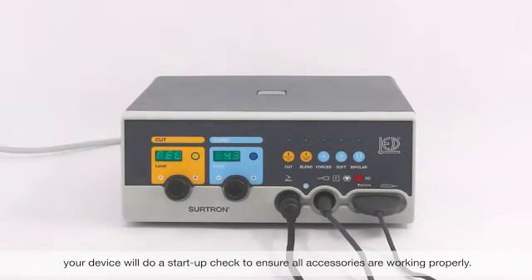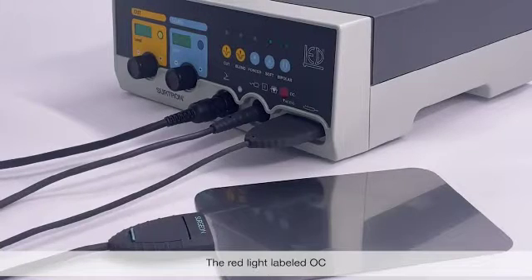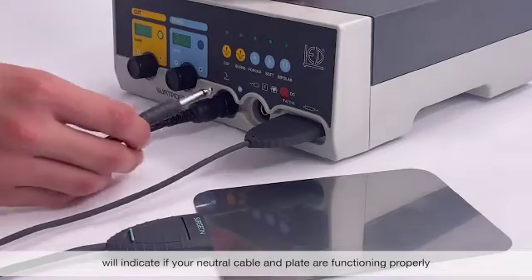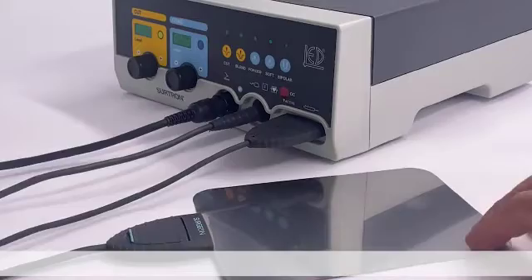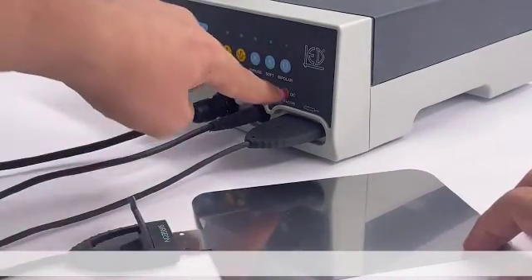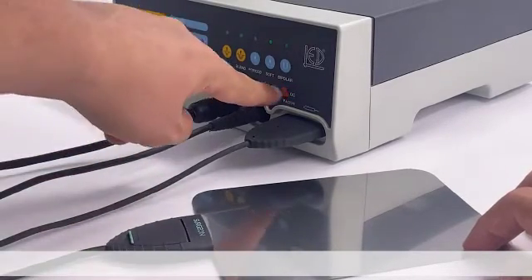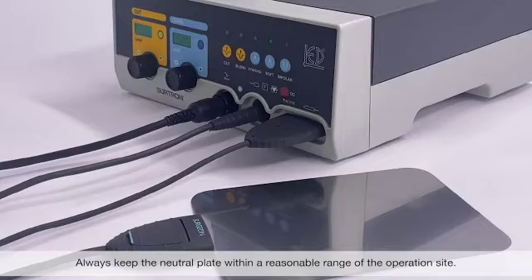When turned on, your device will do a startup check to ensure all the accessories are working properly. The red light labeled OC will indicate if your neutral cable and plate are functioning properly. Make sure to correctly insert the neutral plate as shown. Always keep the neutral plate within a reasonable range of the operation site.